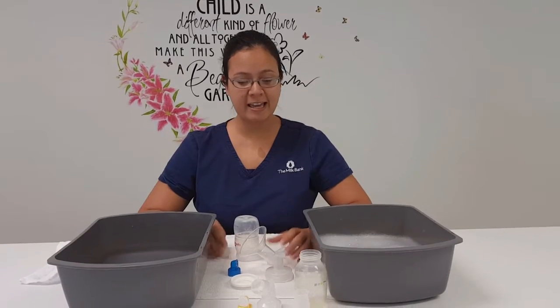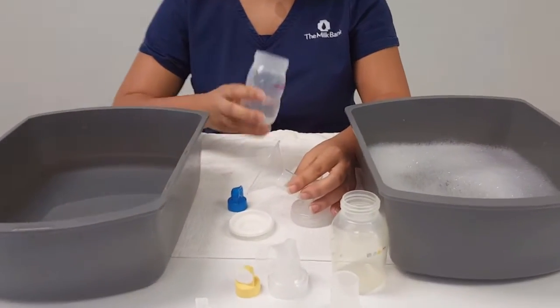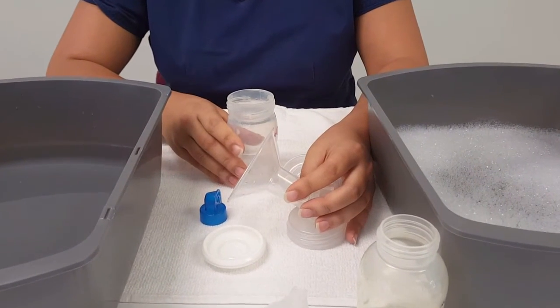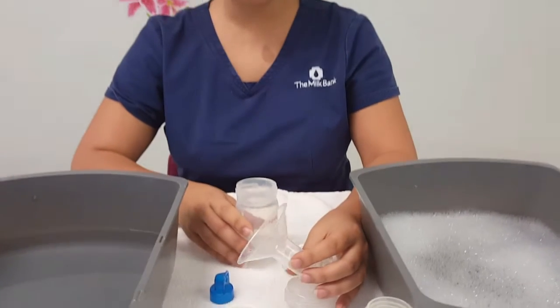A tip for drying: I flip it over and let most of the big drops come out, and then I'll flip it right side up, and so it will air dry the rest of the way. And that's just personal preference. I don't like to use any towels so that no fibers get in there. So that's, again, just personal preference.